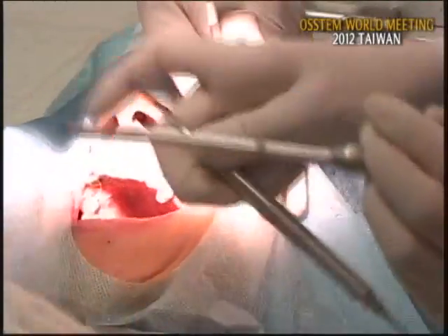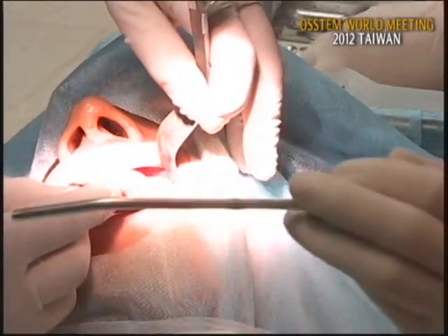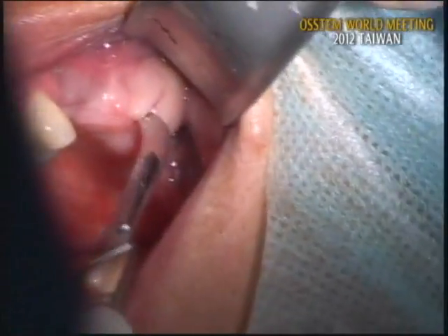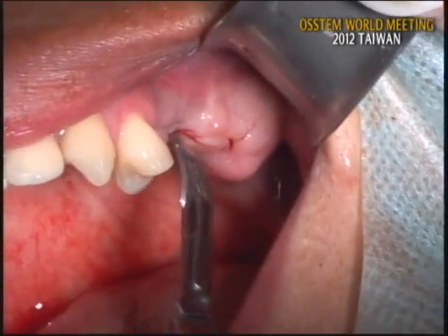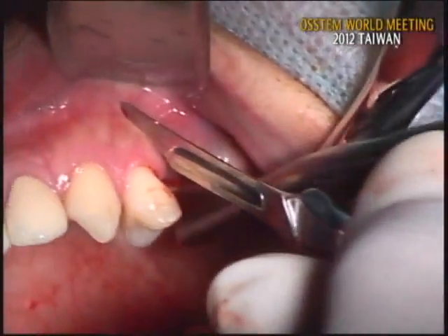Open, please. Right turn. I'll make an incision from the posterior side. Posterior vertical lateral to crestal incision, slightly lingually placed crestal incision. And it's better to use the number 15 surgical blade to make a vertical incision on the anterior side. Here.